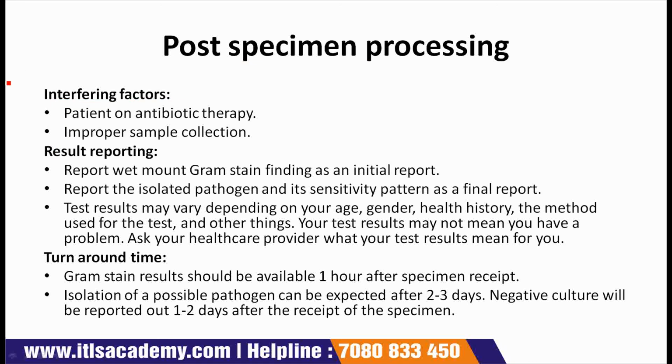Next comes result reporting. The first point is report the Gram stain findings as an initial report. The next point is report the isolated pathogen and its sensitivity pattern as a final report.